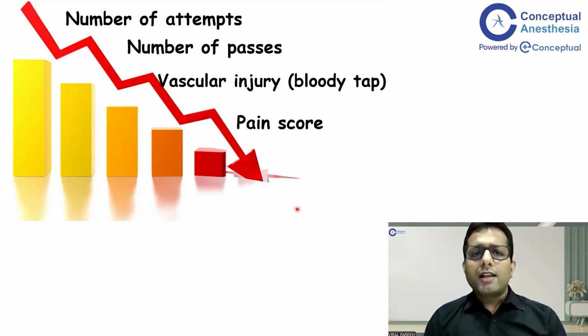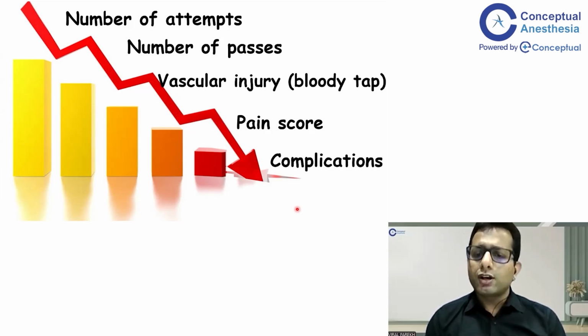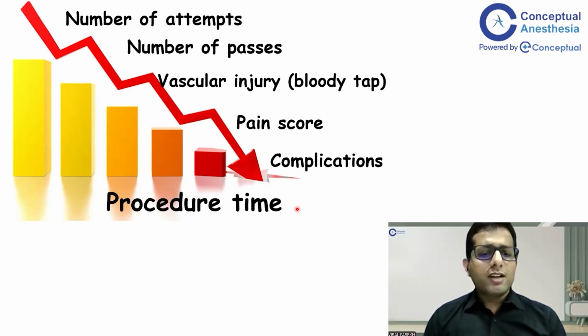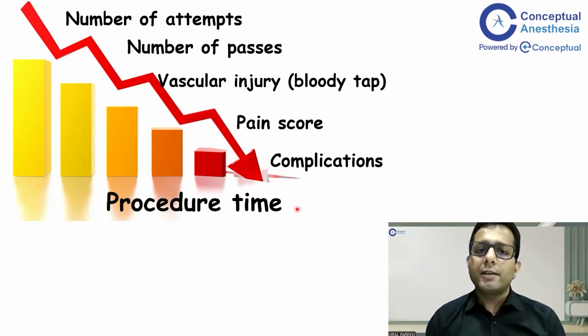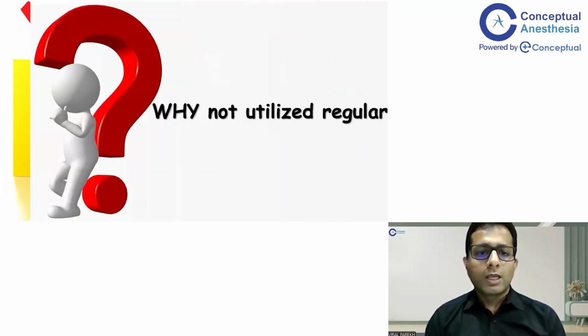It also shows that with the help of ultrasound, there is a reduced pain score in patients. There are fewer complications and improved patient satisfaction. About the procedural time, yes, when you start performing the ultrasound guided spinal or epidural, it definitely has a higher learning curve. So you might take more time in the beginning. But when you compare over a period of time, the end result is definitely better and the procedural time also comes down.